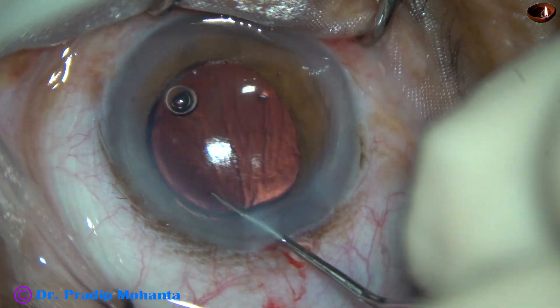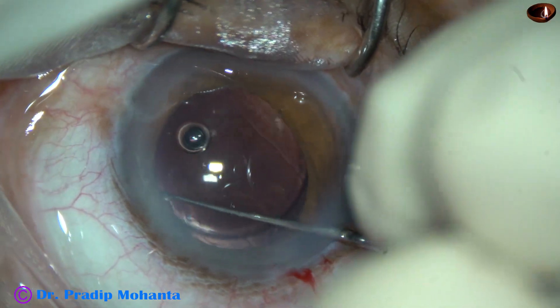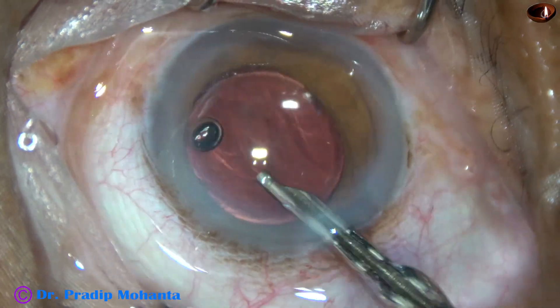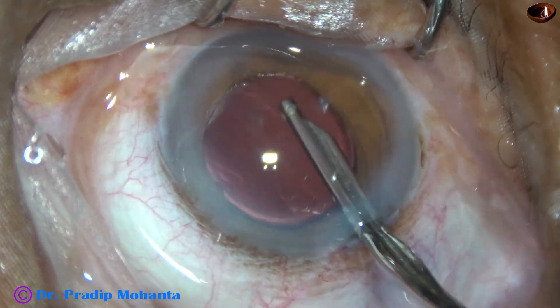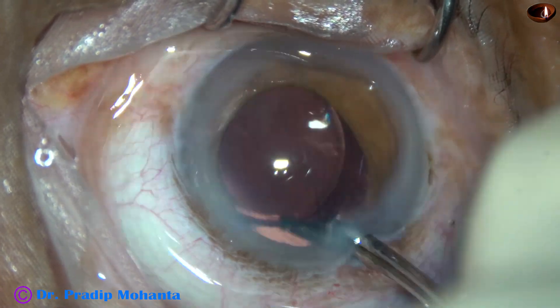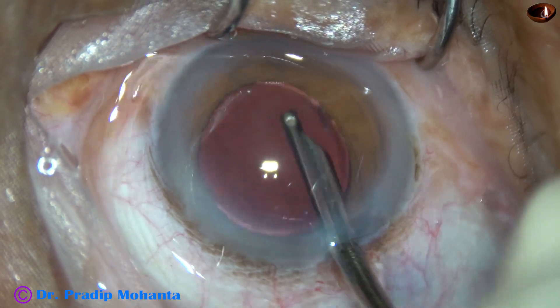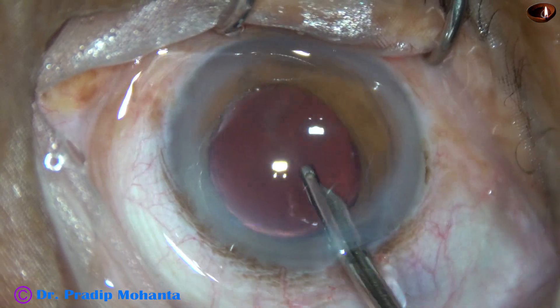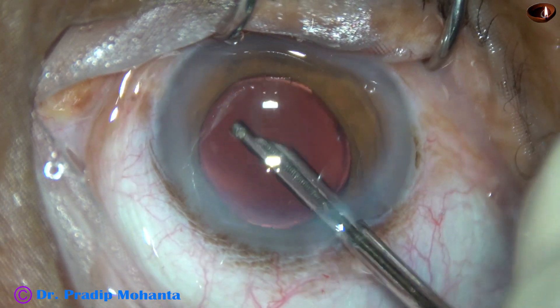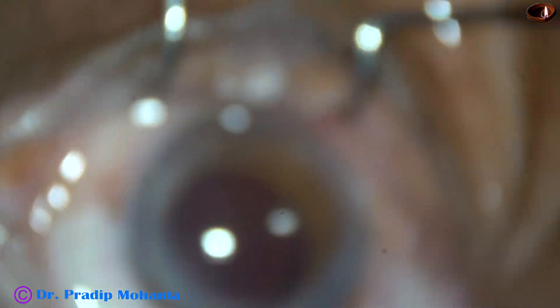This has been a very satisfying surgery. The nucleus was so hard and it has been managed without sculpting and without making any trench. That is the nicest part of the surgery. Whenever we use the ultrasound within the substance of the nucleus, the nuclear substance absorbs most of the heat and the ultrasonic energy does not travel towards the corneal endothelium. The corneal endothelium will remain very clear the next day — and that is what happens in my surgeries.